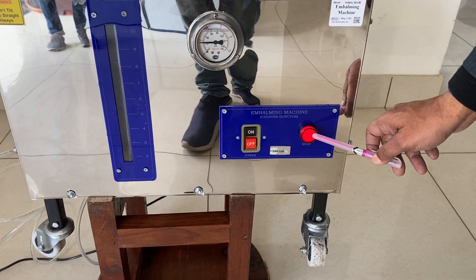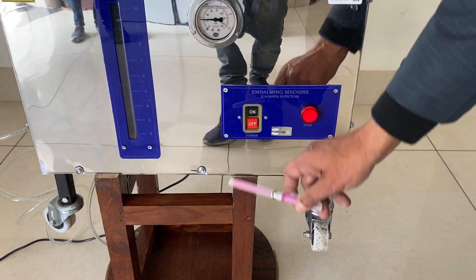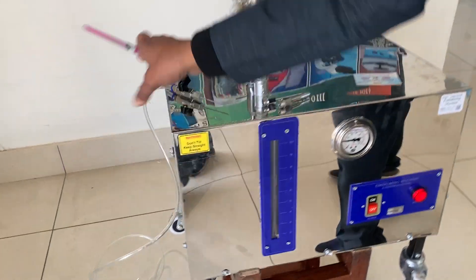And then switch it on. The indicator tells you it's on. These wheels are for moving, and there is one tube here which is attached.